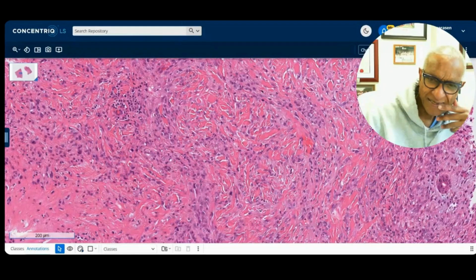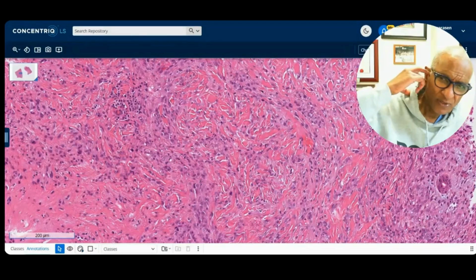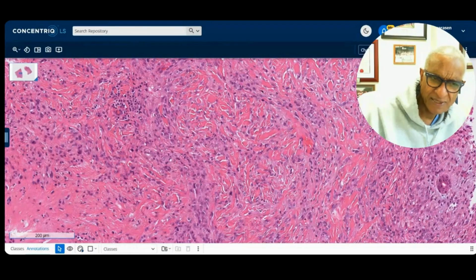INI1, of course, is the key factor in this. But because of the epithelioid morphology, you may ask yourself, is this epithelial? Doing the cytokeratin and EMA, both of them would be positive as well. But CD34 is useful to rule out carcinoma, because CD34, in my own personal experience, is hardly ever positive in carcinomas, meaning that they're negative in most carcinomas. So it's useful seeing a CD34 positive. Then I know it's not a carcinoma, and I know it's not epithelial. There is one that's positive, which is the NUT carcinoma. So if you have others, you can share with us. But the CD34 is usually so.